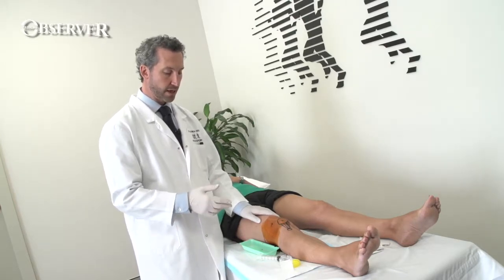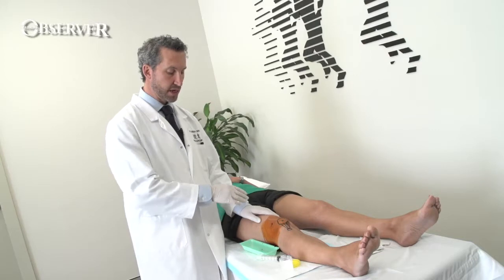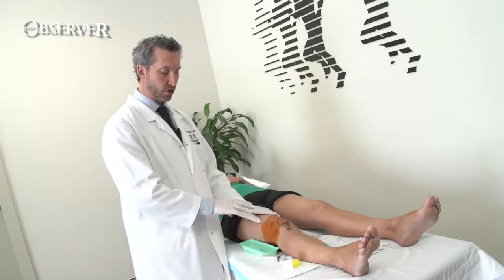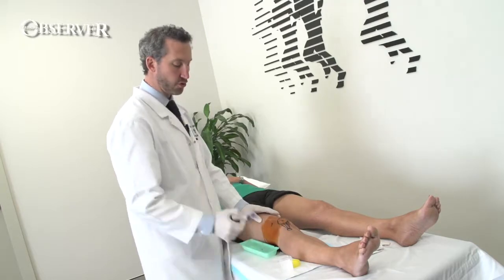As with all injection and aspiration techniques, the knee must be prepared. You paint your betadine on, wait for it to dry, and get your needle ready.